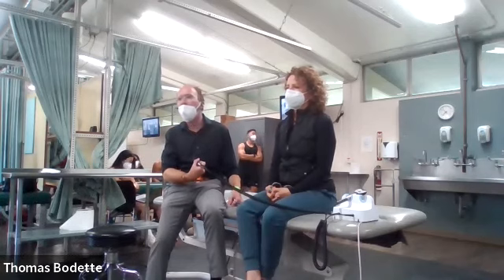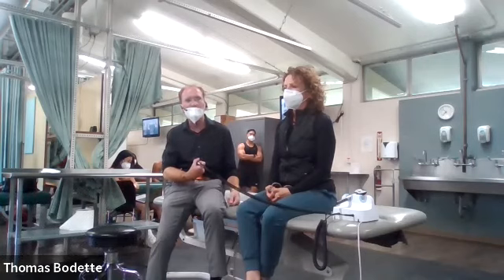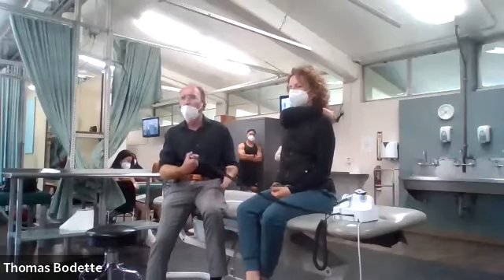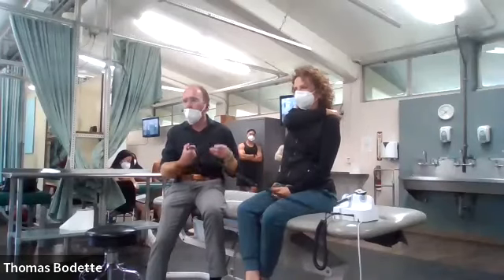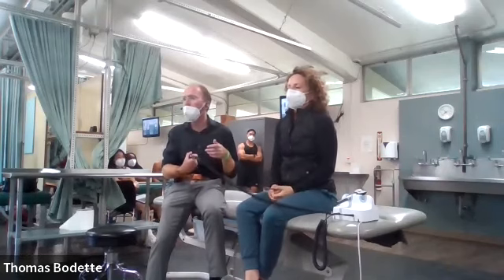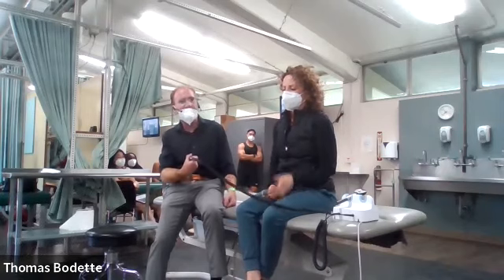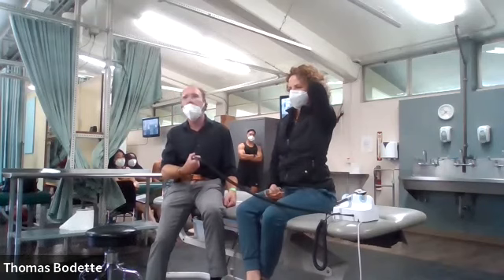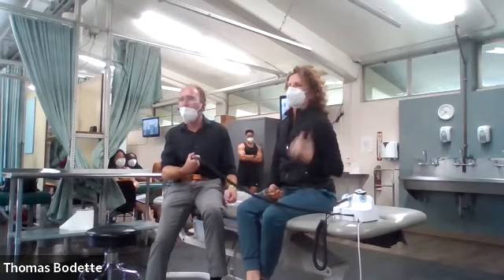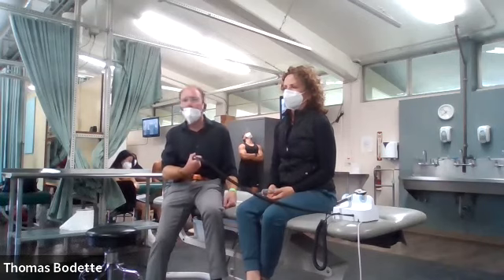So that's pretty much it. Abnormals: it could be excessively red. There could be effusion. That could be an infected middle or external ear. There could be discolorations, foreign objects, excessive cerumen, and problems or damage to the eardrum itself, altering the position of the cone of light and possibly having physical damage to the tympanic membrane. We can't really see anything past that. You might be able to see a glomus tumor if it was in the middle ear, but just like acoustic neuroma, they tend to affect the inner ear more often than not. So don't worry about that one.